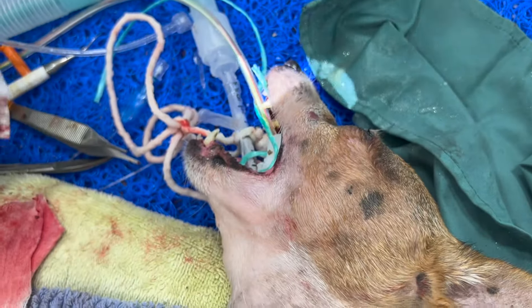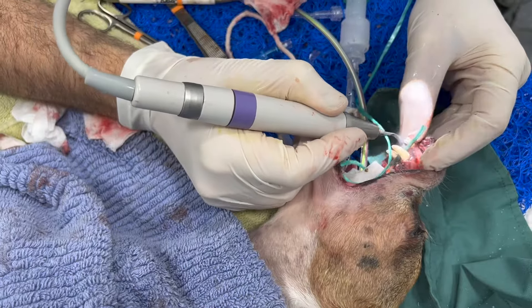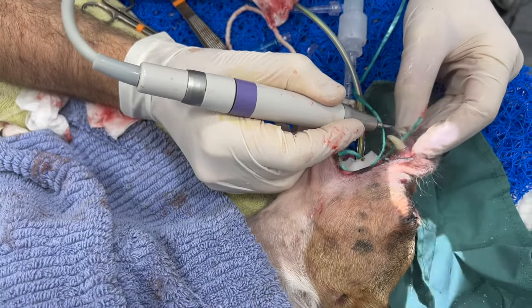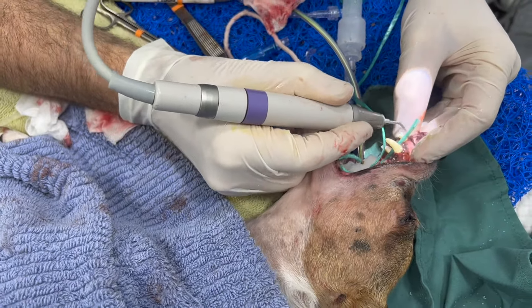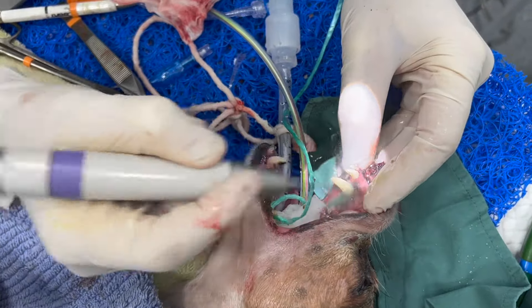So now we've got three teeth out. And just like with human dentists, it's quite difficult to keep good posture when you're doing all these procedures.